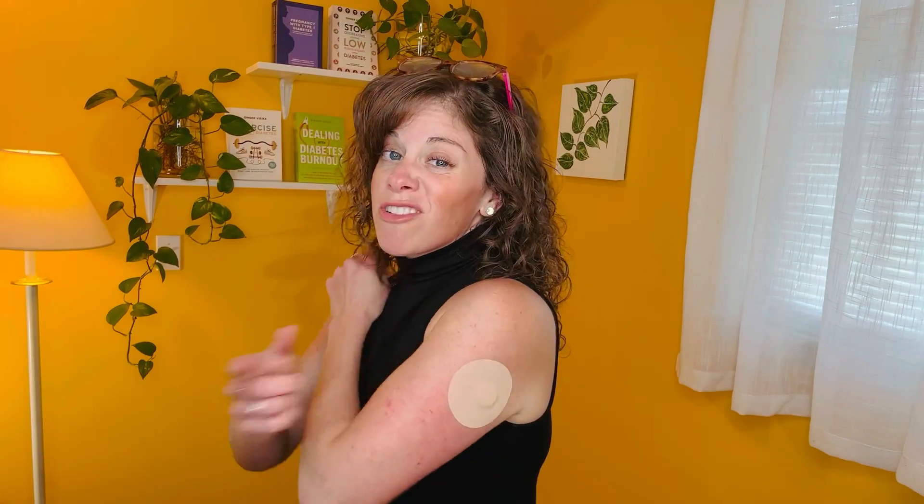Overall, I'm really glad I started using the Libre 3 and started letting a CGM alert me again. If you want to try something new, if you've never used a CGM or you're already using a different type, I'm personally really appreciating the way the Libre 3 works — except for that one that died yesterday for no reason. But it's technology, that happens, and they're sending me a replacement. The biggest benefit of using a CGM is all about time in range. Get tips on improving your time in range right here.